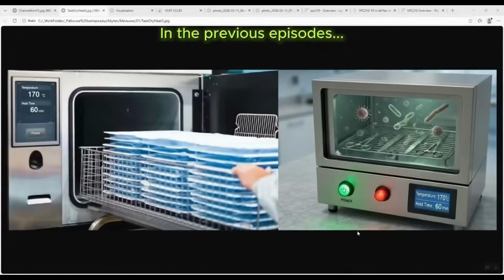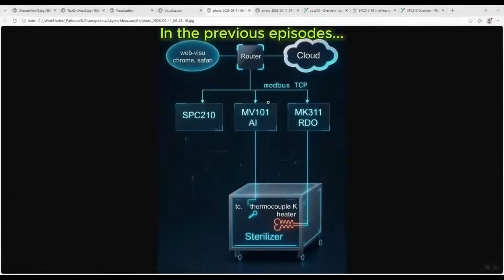Let's develop an automated control system for an industrial dry heat sterilizer. All the devices mentioned are connected to each other through a router that has internet access.